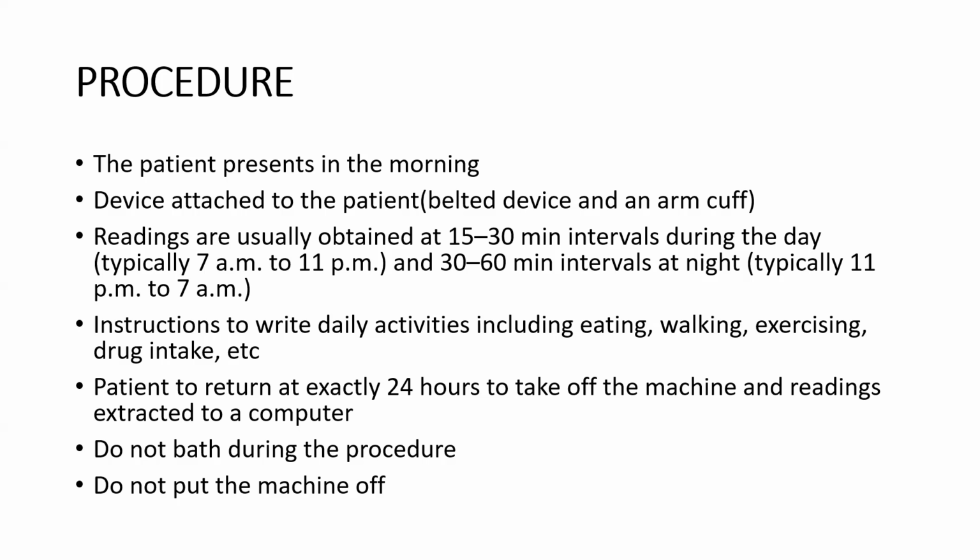So a minimum of 70% usable BP recording is required for a valid measurement session. This translates to more than or equal to 27 measurements over 24 hours, preferably 7 nocturnal readings and 20 daytime readings.